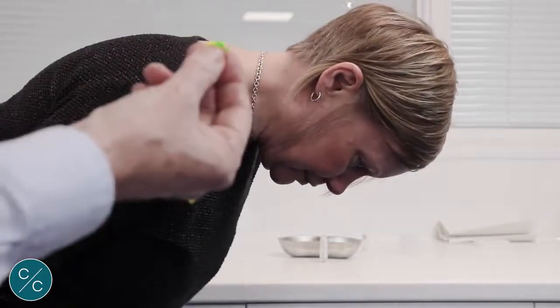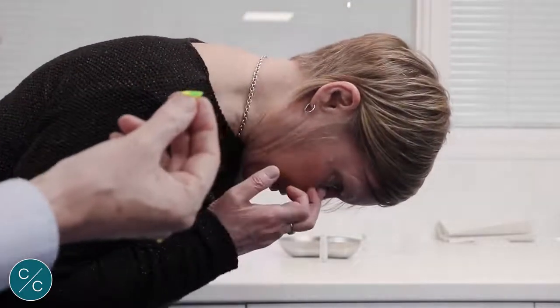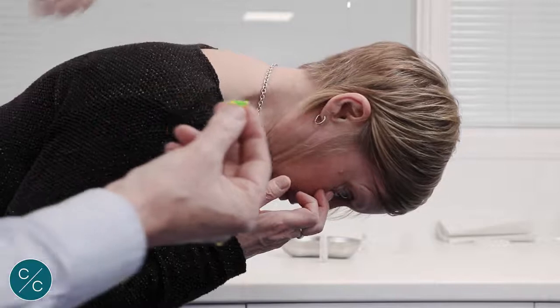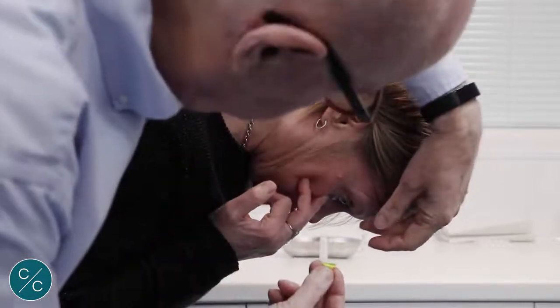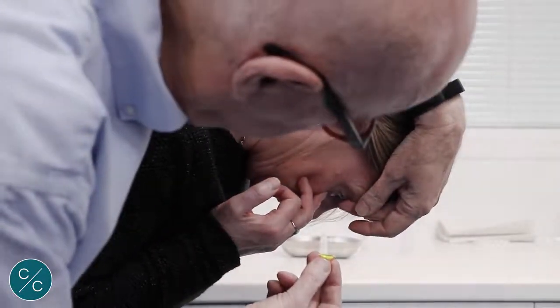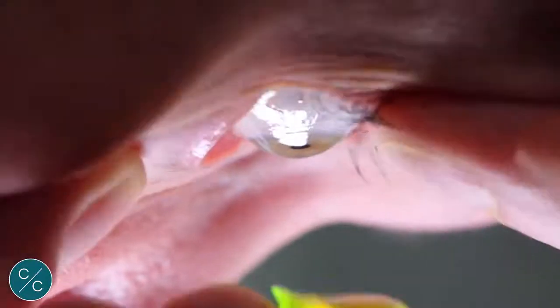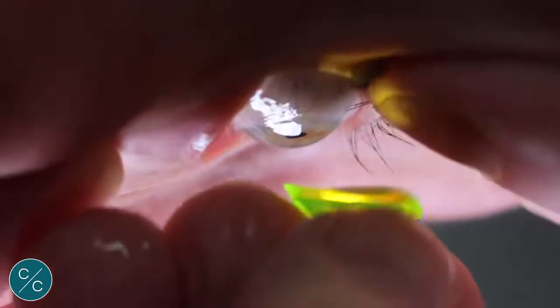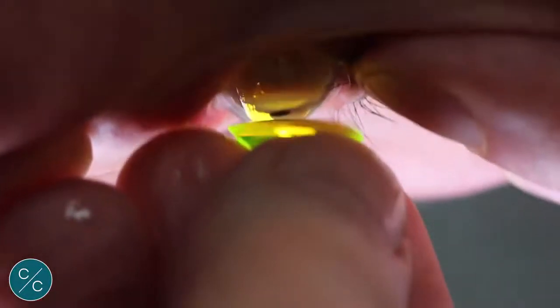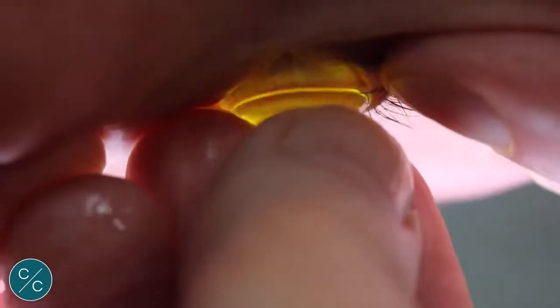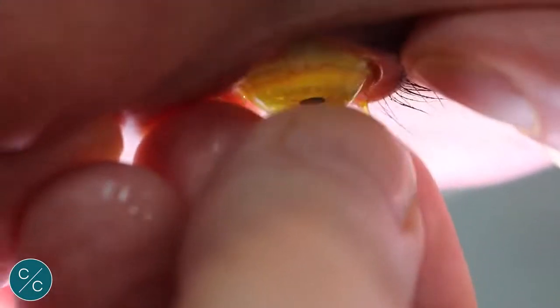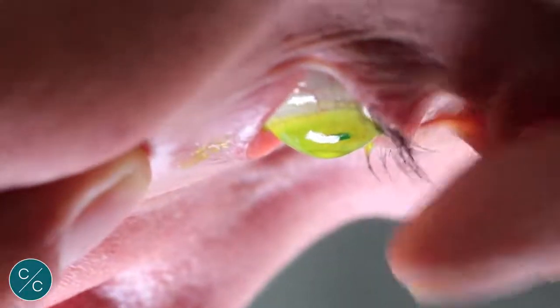We'll get you to lean forward about 45 degrees from the waist, that's good, chin down to your chest, pull your lower lid down with your middle finger. I'm going to lean over and hold your top lid out of the way and here comes the lens. I'm going to rest on your hand and you'll feel the cold of the solution, then a gentle press as the lens goes on, put my hand away and the lens is in.